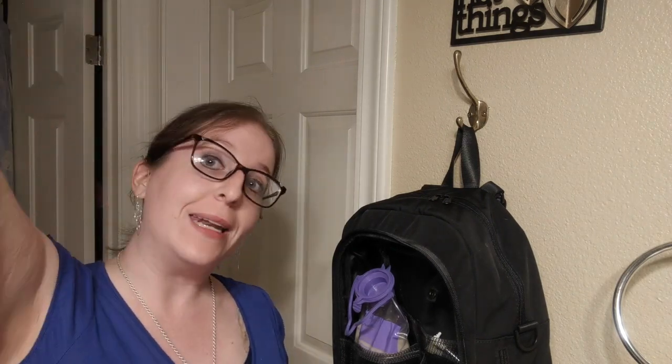My stepdad actually installed that for me just specifically for this purpose. You can also, if you've got an IV pole that typically comes with your pump and all of that, use that. It's just easier if you hang it to be able to put everything in. The hook is really handy, one, because this is where I do my meds and I prepare my feeds, but two, with my pacemaker surgery, with my left arm, I can't lift over my head, so that means I can't really use my IV pole to set up my feeds with the backpack right now.